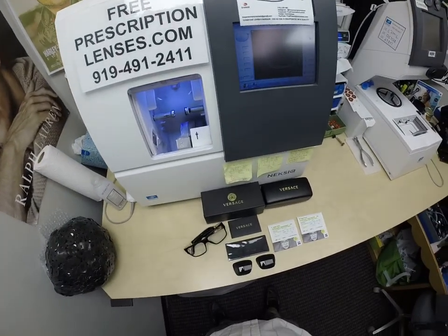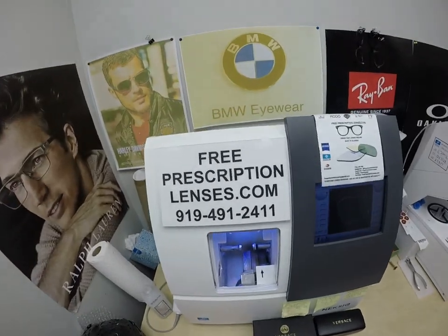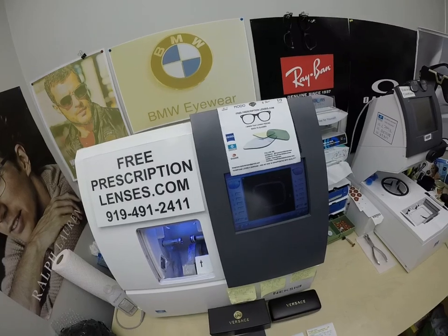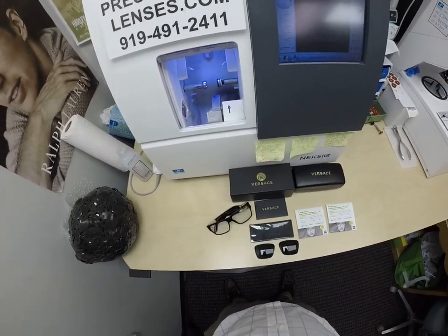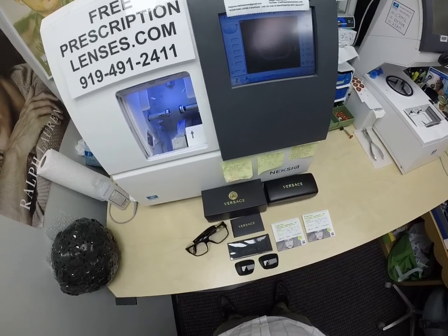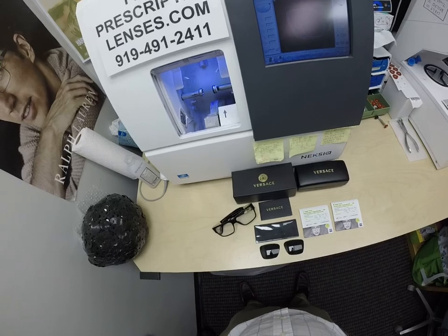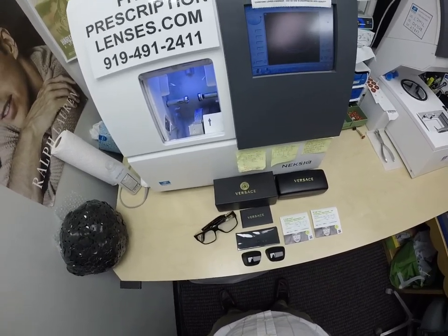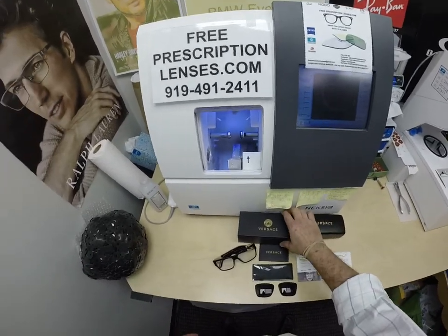Hello everyone, and a very special thank you to Will in Clear Springs, Maryland. This is freeprescriptionlenses.com, where everyone loves a bargain and no one is disappointed with quality. Will's making sure that I am the hardest working optician in the industry. My name is C. More Better, but call me Mo Better, because I'm going to show everyone Will's fourth pair of glasses in one month.